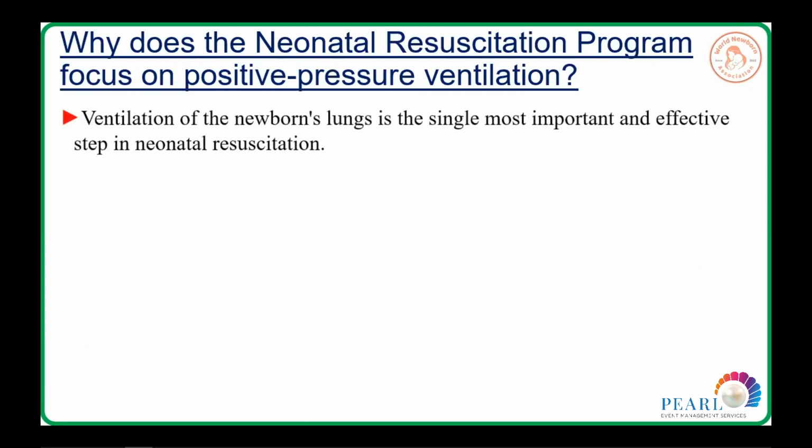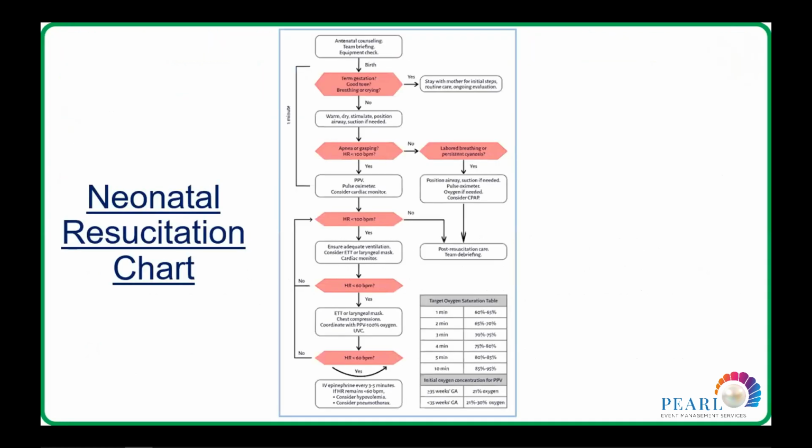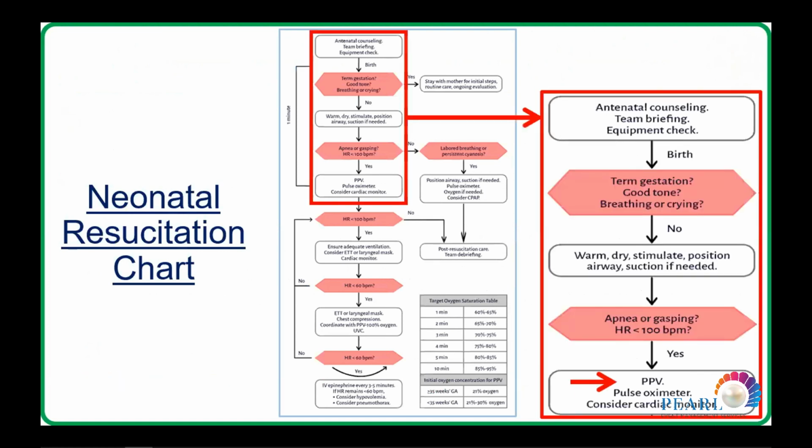The ventilation of the newborn lungs is the single most important and effective step in neonatal resuscitation. Learning how to provide PPV is the foundation of neonatal resuscitation. Here in the chart, we see the position of the positive pressure. It comes second to the initial steps.